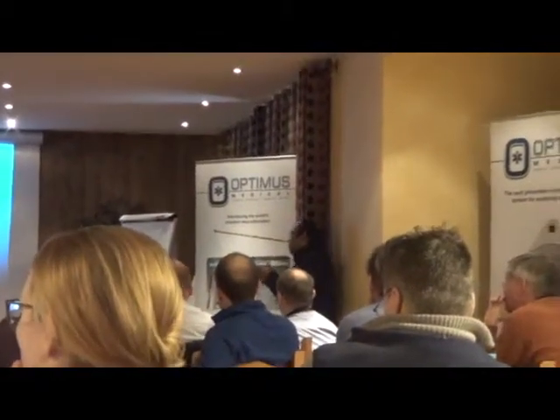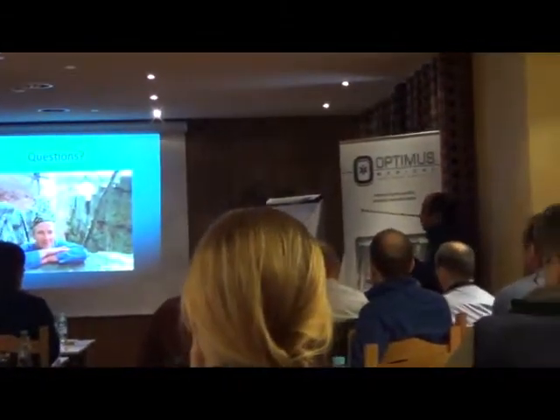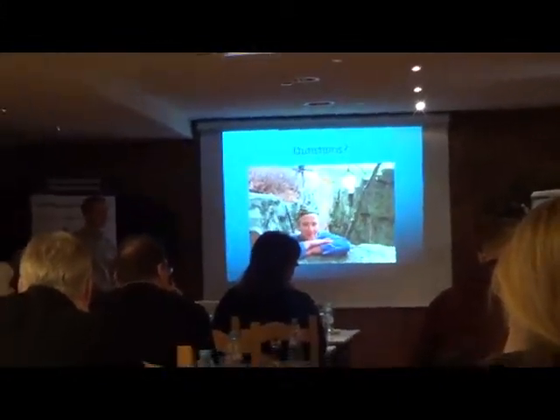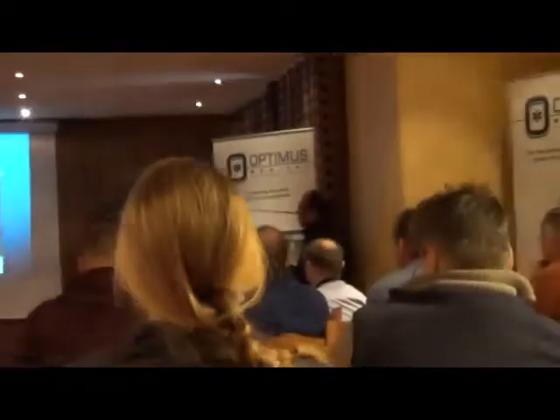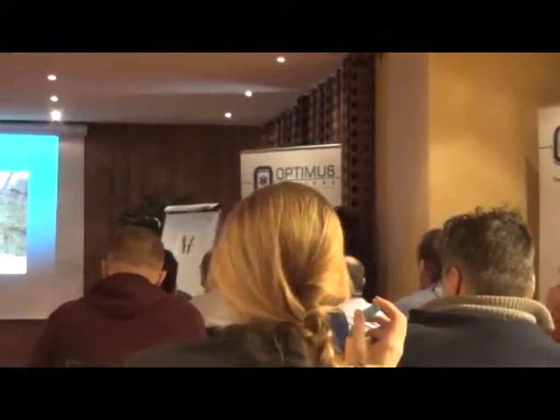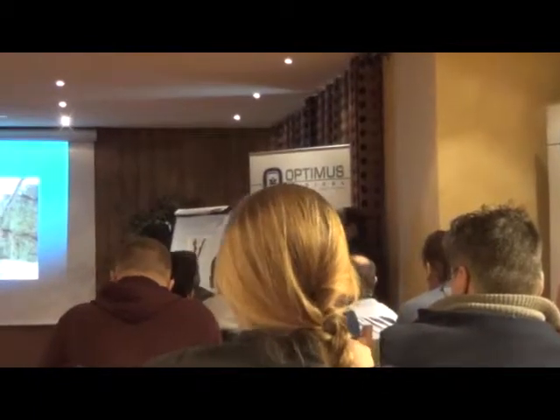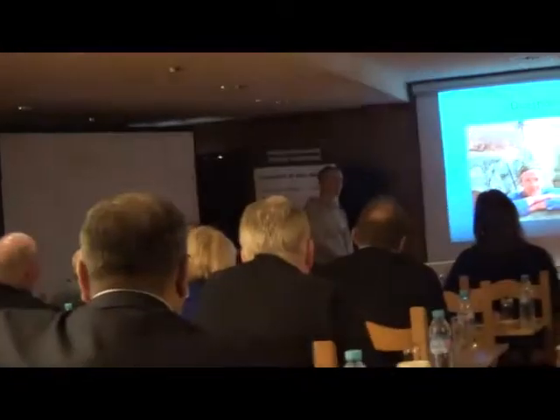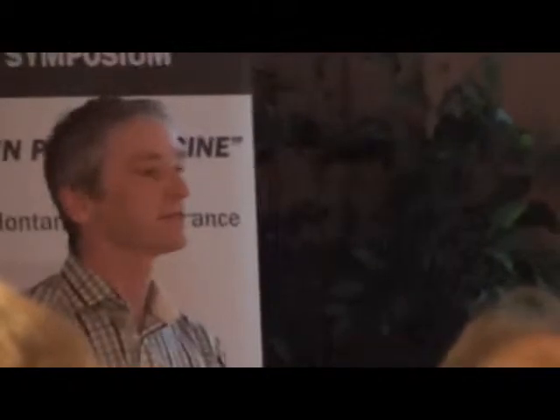So, can I just ask you something? There are quite a lot of pain clinicians, particularly junior pain clinicians, who are not very happy doing anything above sort of C7. And one of the things I've suggested to them was, why don't you put your needle at T1-2 or even T2-3 in the interlaminar space and thread a catheter up? It's a good idea. It's done frequently. But the idea behind my needle placement is you have to put the needle as close to the lesion as possible. You can do the same with the catheter. True. It's more laborious with the catheter than with the needle.